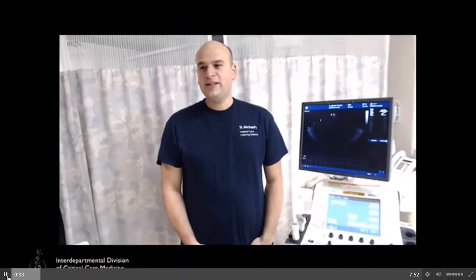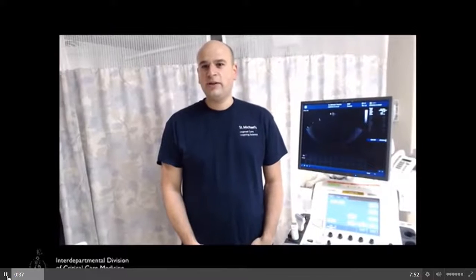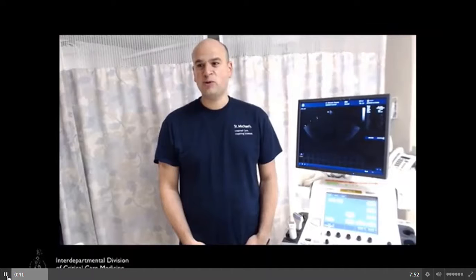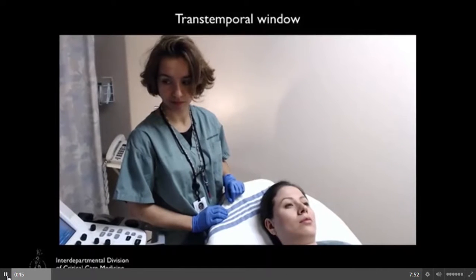A full TCD examination may include examination of the transtemporal, the transforaminal, and the retromandibular windows, and may also include optic nerve sheath diameter measurement. We will start with the transtemporal window.